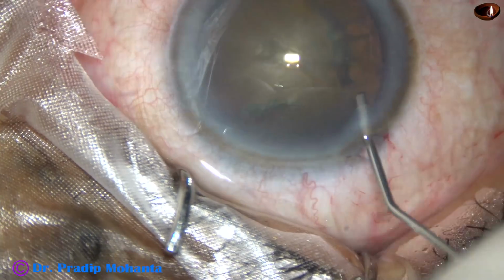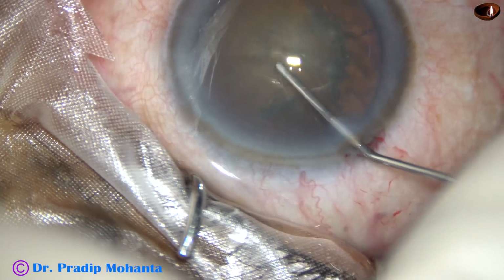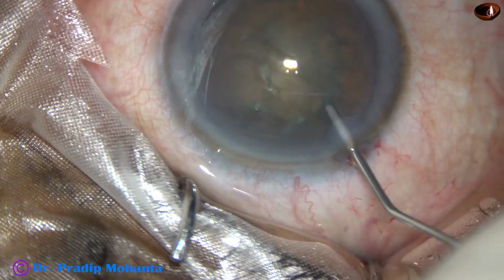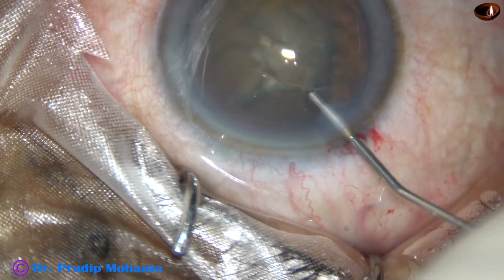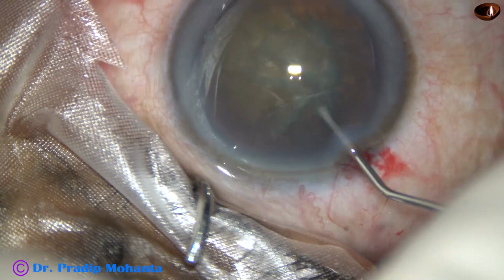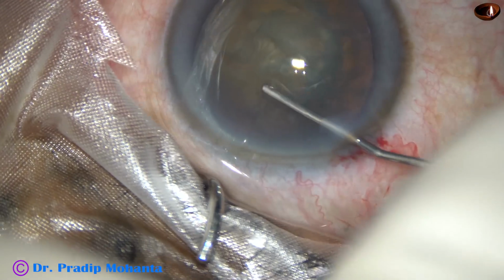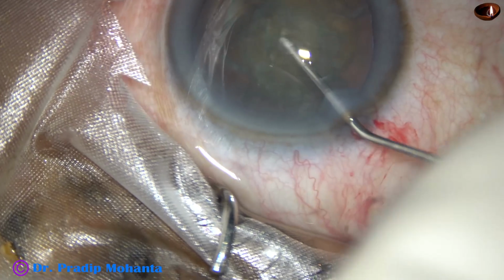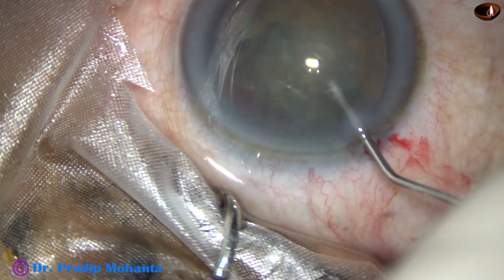The nucleus is ballotted, but the hydro is not yet good. The rotation is not satisfactory. So I inject some more fluid over the surface of the cataract, rotate it for some more time.